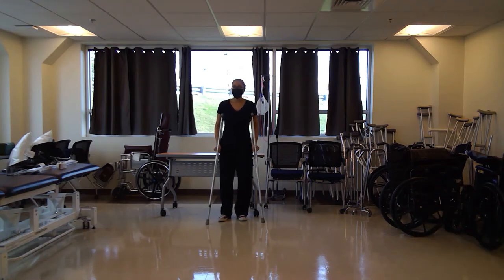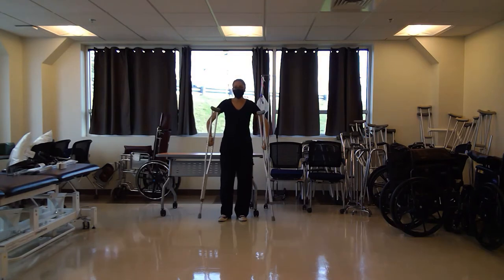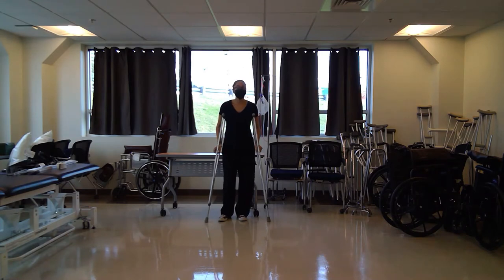I'm with the PTA program at Bay State and I'm going to be demonstrating a four-point gait pattern and a four-point modified gait pattern. I'll begin with the four-point gait pattern using two axillary crutches. This can also be done with bilateral canes or two lofstrand crutches.